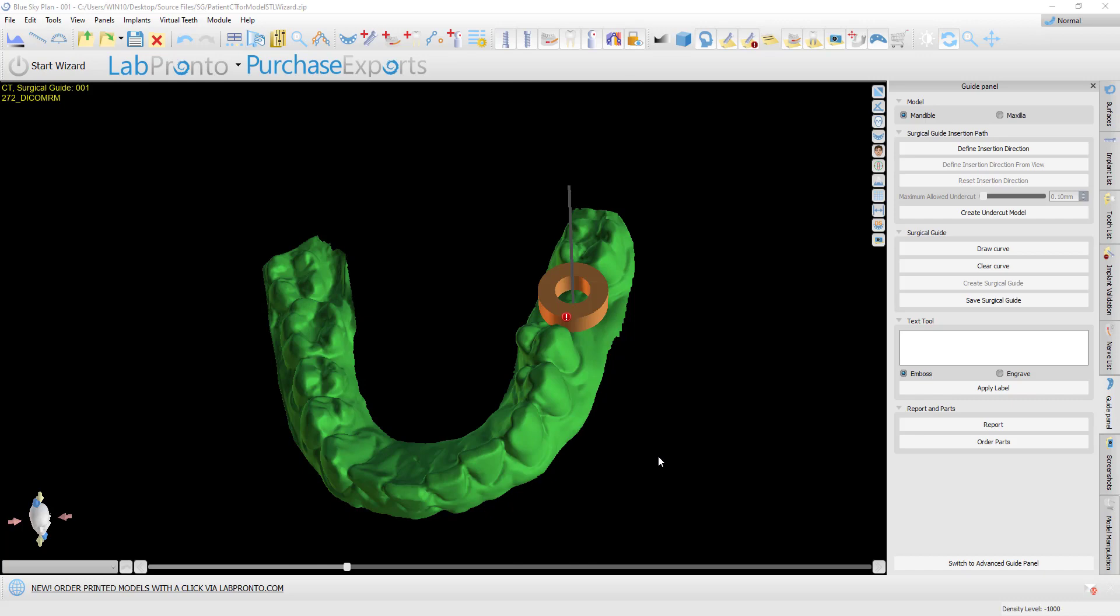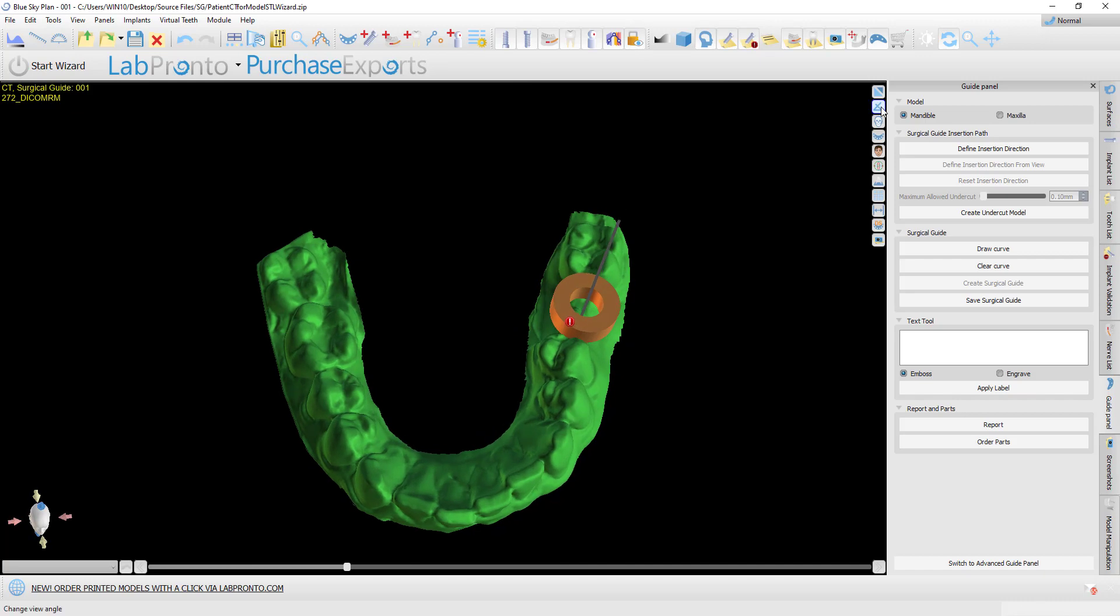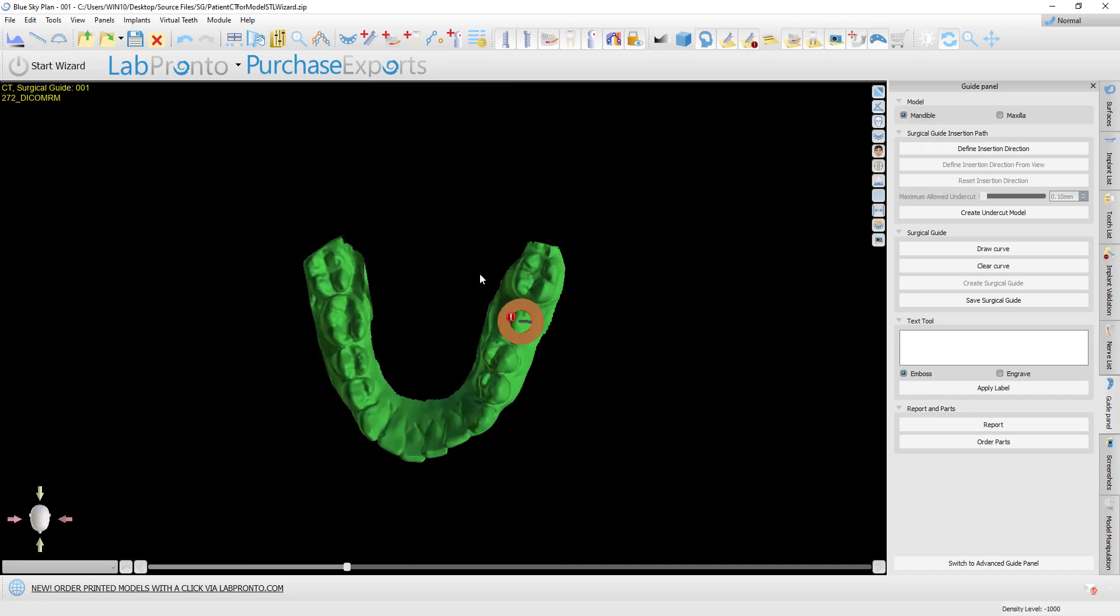Before I discuss how it now works in version 4.82, let me discuss how it worked previously. In previous versions, undercuts were automatically removed at a perpendicular 90-degree angle to the surgical guide.